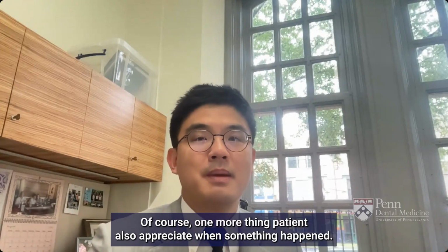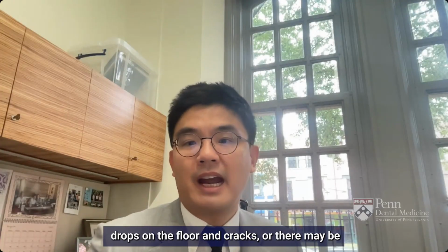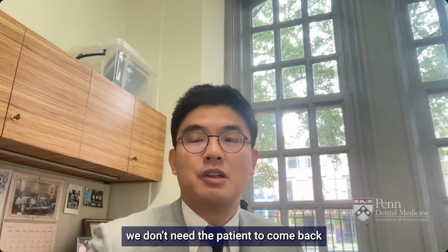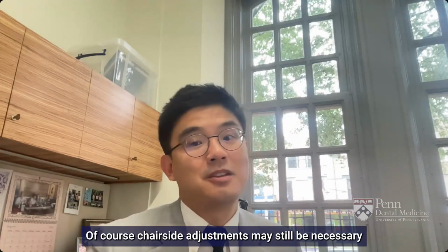One more thing, patients also appreciate it when something happens. For example, people have a nightguard and the dog eats it, or it drops on the floor and cracks. If it happened within a certain period of time, the tooth is still in the same position, so we don't need the patient to come back. We can refabricate the nightguard and deliver it to the patient. Of course, chair side adjustments may still be necessary.